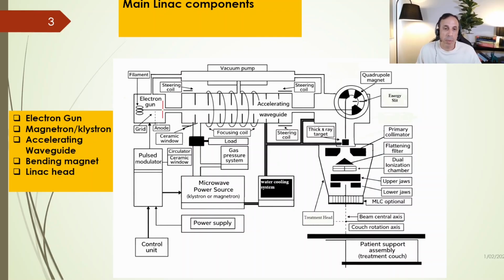The other important part is the pulse modulator, which sends carefully timed and high voltage pulses to the electron gun.